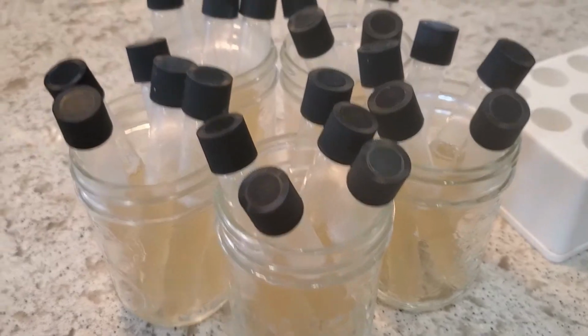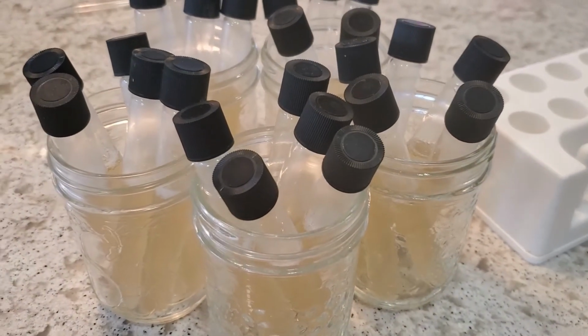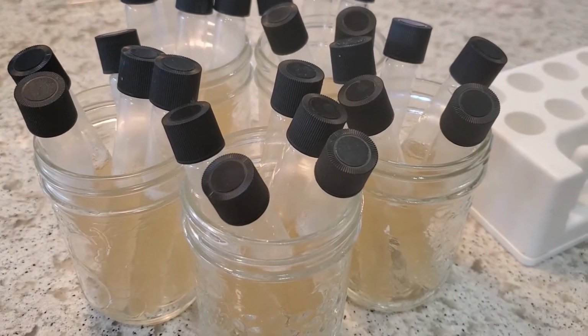Okay, well, I got a little bit greedy. I actually wound up getting 25 vials out of this, and you can see I have just a little bit of this wort left in here. So it's time to get these into the pressure canner and get them sterilized.